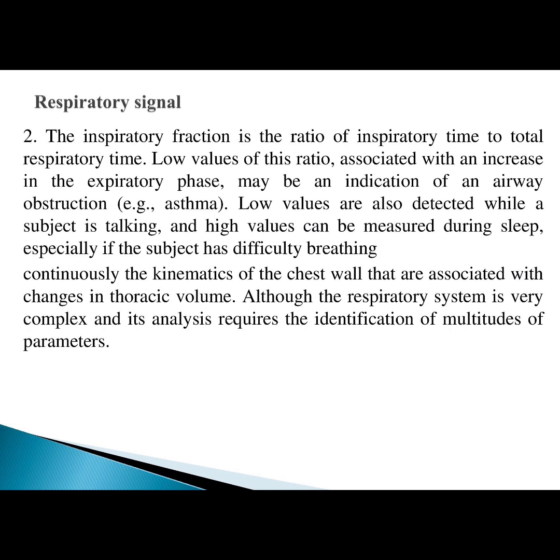The inspiratory fraction is the ratio of inspiratory time to the total respiratory time. A low value of this ratio, associated with an increase in the expiratory phase, may be an indication of an airway obstruction, for example asthma.